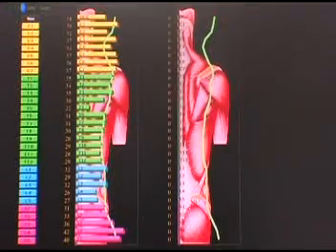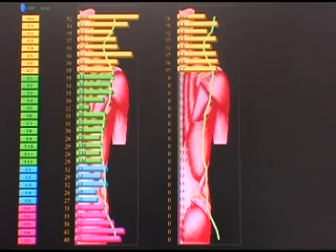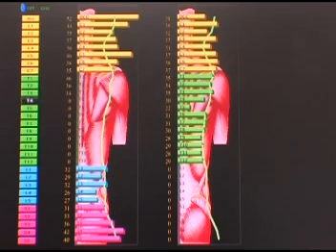Each bar graph represents the resistance provided by the patient to the analysis impulse. A low bar represents lower resistance than a high bar. The resistance is determined by the condition of the tissue surrounding the joint, as well as the movement of the joint. When you look at the computer screen, you see that there are three different graphs.